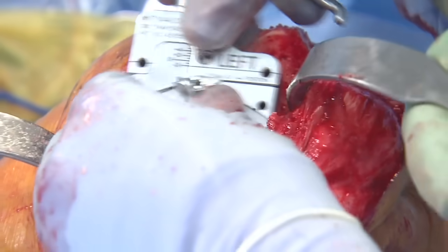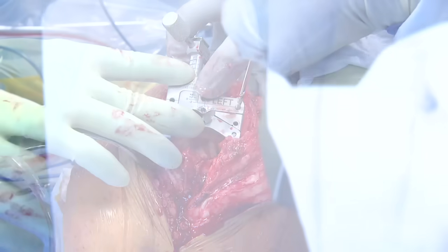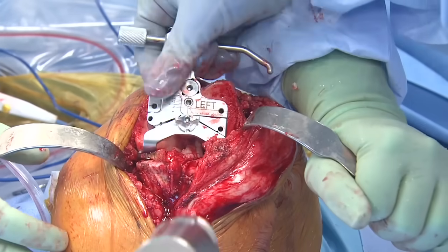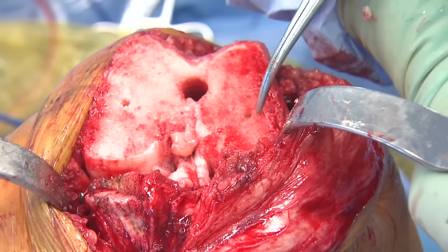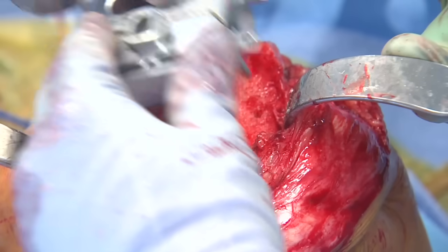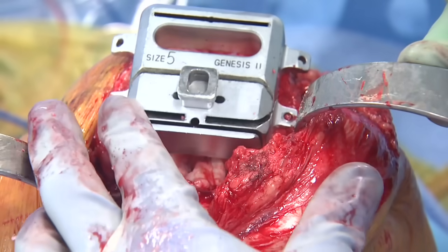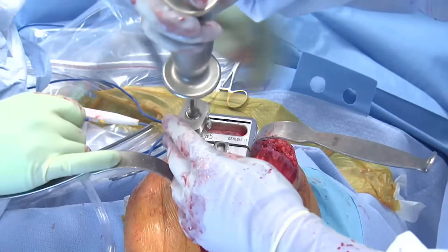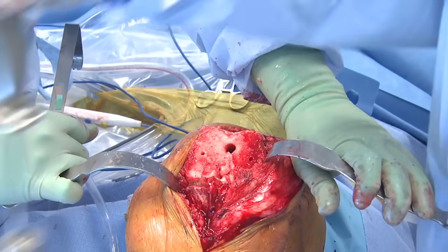Through use of the distal femoral cutting guide and posterior referencing system, the appropriate implant size and position is identified. Identified holes provide landmarks for placement of the final distal femoral cutting block. Anterior chamfer cut is made and the block is removed to allow appropriate inspection of the anterior cut.